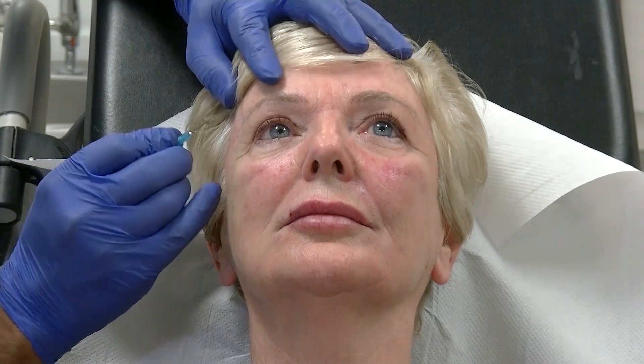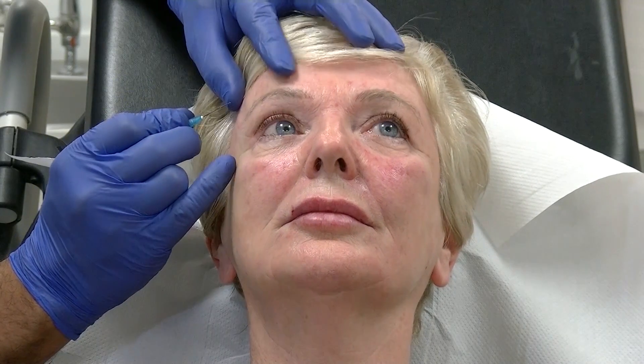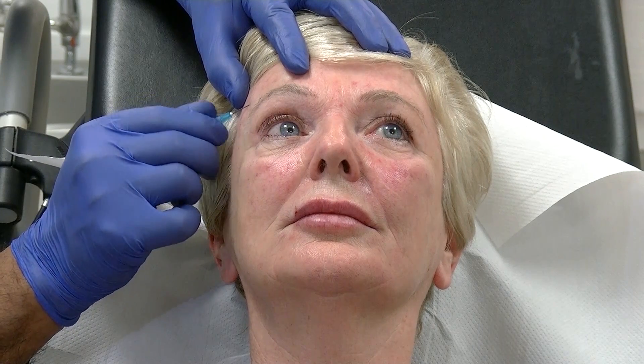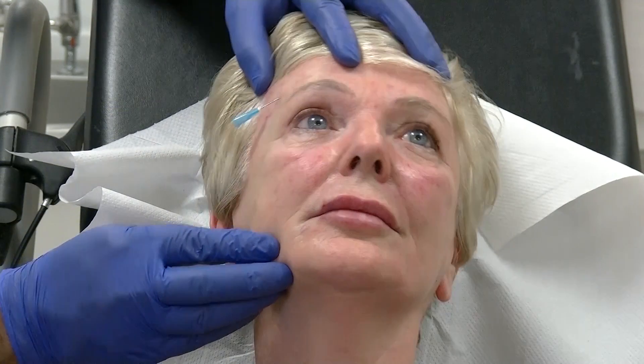Next we're going to use the lift — the brow lift. We look for blood vessels; we can see a little vessel there. So we're going to have a lift up, a sharp scratch coming up, around and around, make it a little bit wider, turn your hands a little bit that way.